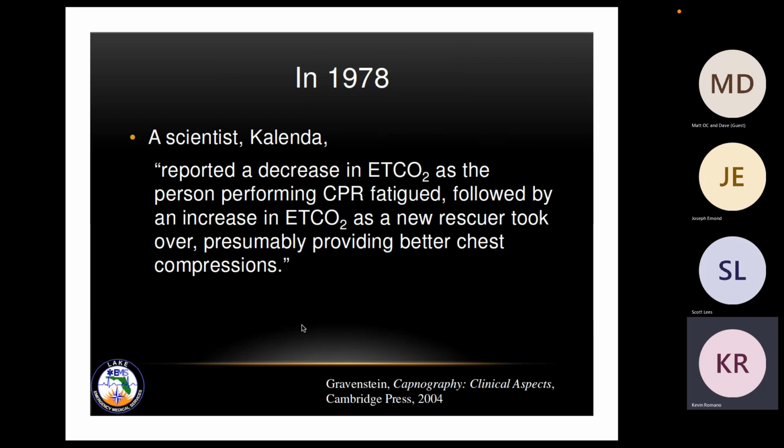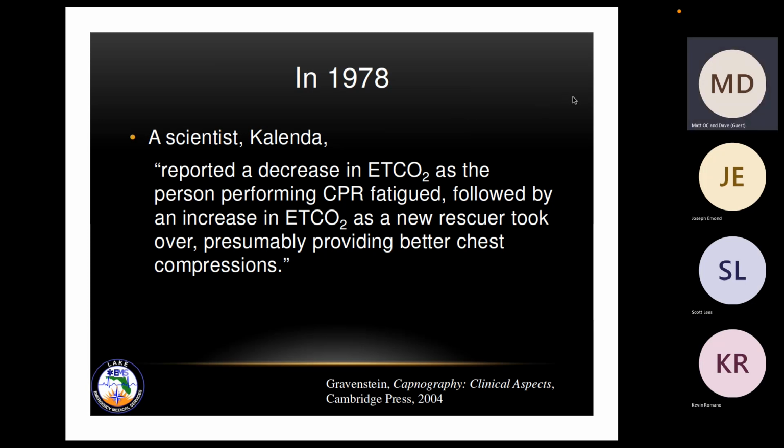So let's go back to 1978. Some of us were not born yet. For some people, you guys were alive. So a scientist reported a decrease in end tidal CO2 as the person performing CPR fatigued, followed by an increase in end tidal CO2 as a new rescuer took over. Imagine that. In 1978, they found this. It's funny he's reporting it in 2004, though.